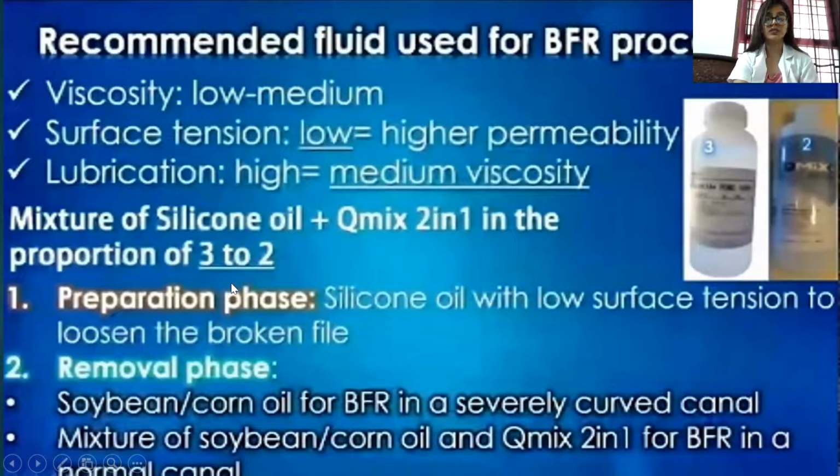The viscosity should be low to medium. Surface tension should be low, which will lead to higher permeability. Lubrication should be high, which leads to medium viscosity. Mixture of silicone oil plus Q-mix 2 in 1 in the proportion of 3 to 2.